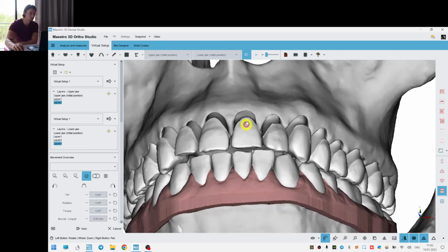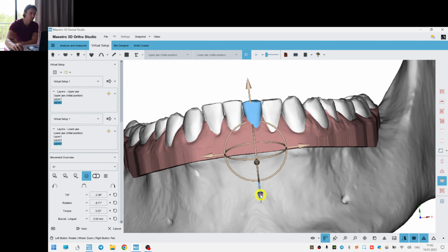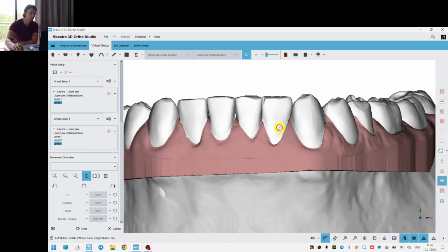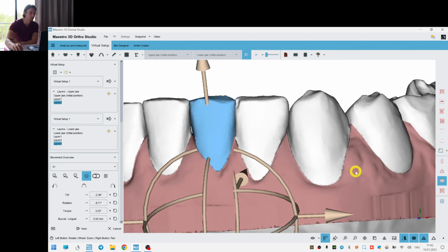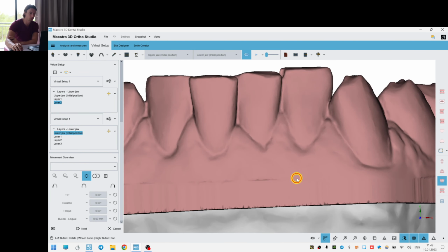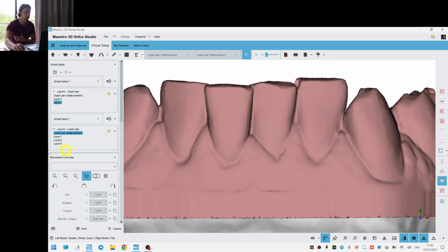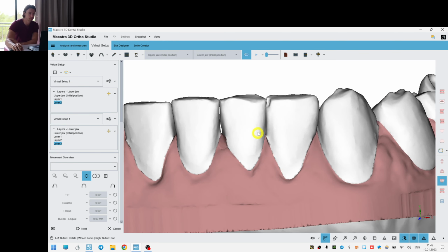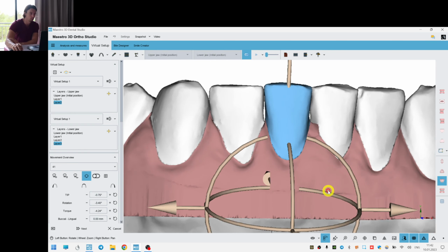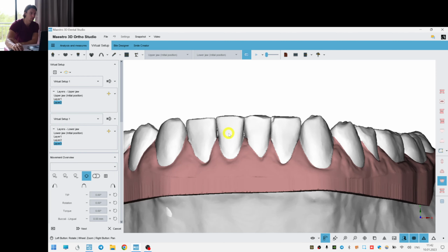And now, yep, I think we should add some intrusion. It's obviously here. Yep, looks better now. I think this is just an imperfection of the scans, but for sure we should expect some black triangles. For this case, it's normal if we got some. We can reduce them by adding more stripping, more IPR, but we can make the decision once we get to this final stage.